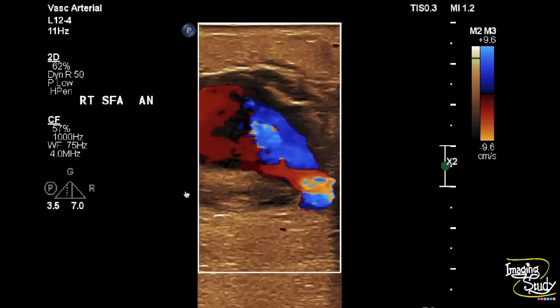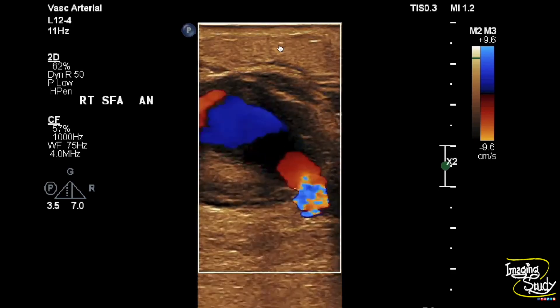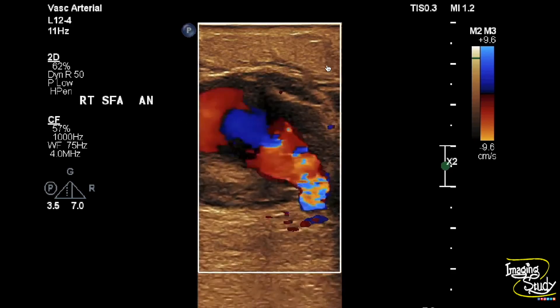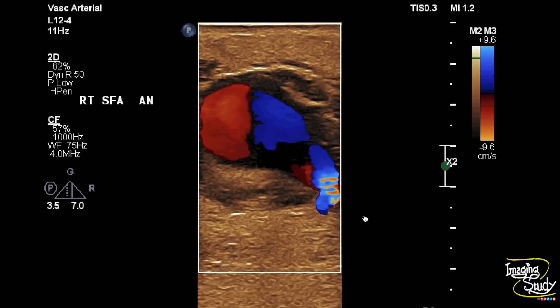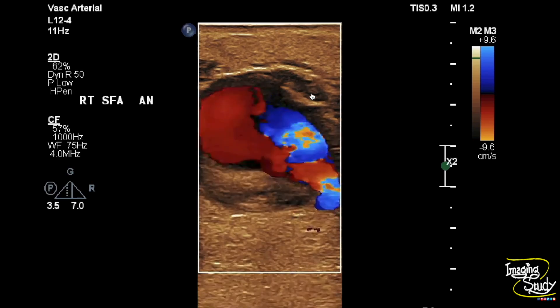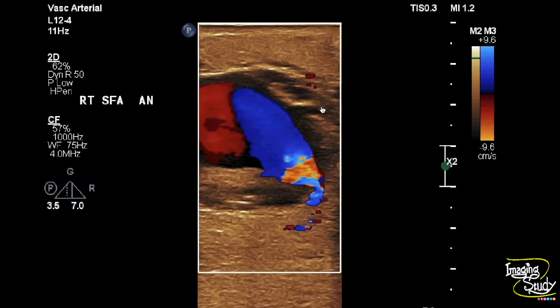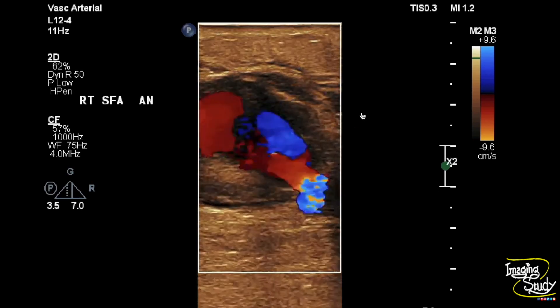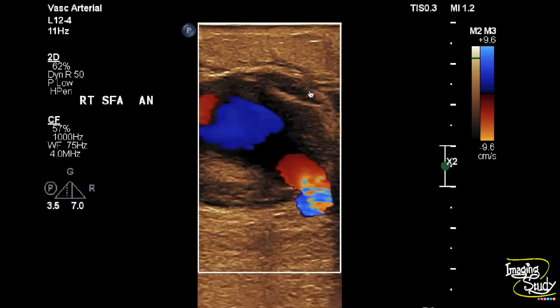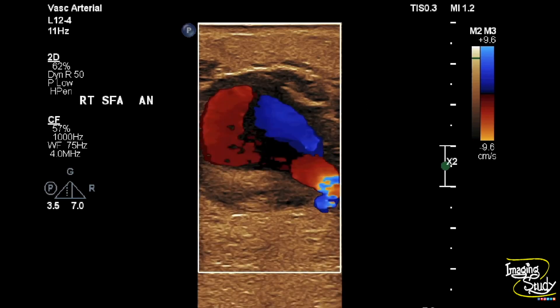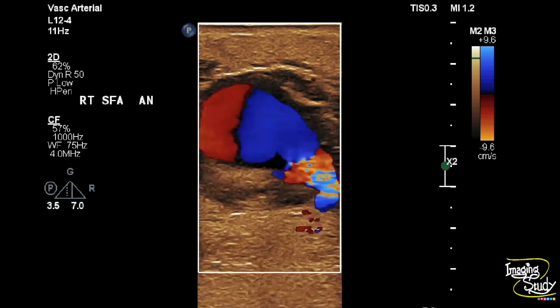These are the mural thrombi. The subcutaneous tissue is edematous, and you can see the adventitial wall here along with some heterogeneous area adjacent to it, indicating the peripheral hematoma.